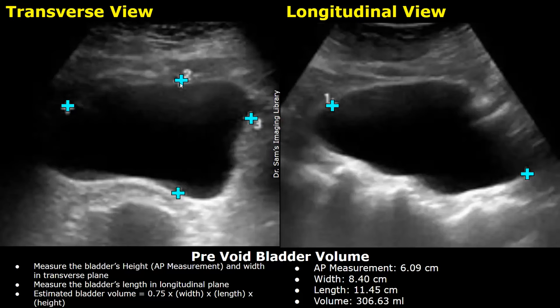After that, you can measure the width of the full bladder by placing the calipers horizontally. Try to get the longest dimension. This is the width of the bladder.